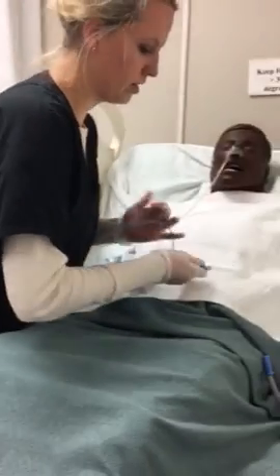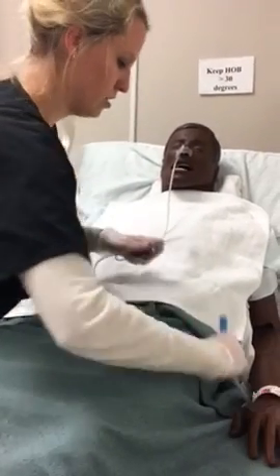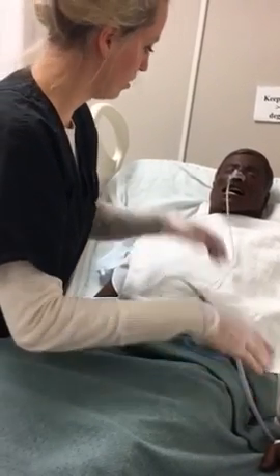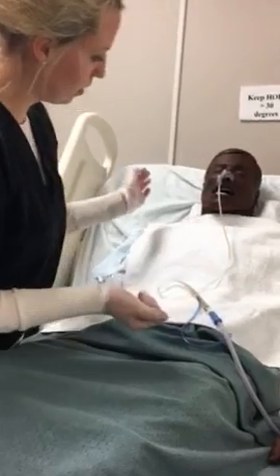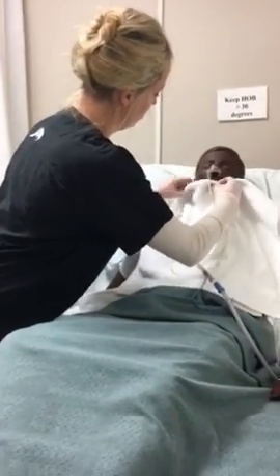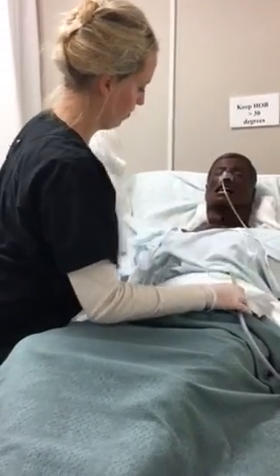Okay, and then I'm going to attach the tubing to some suction, and turn the suction on, make sure it's working properly. And then I'm going to perform some assessments on the patient. Mr. Templeton, are you experiencing any severe allergies currently? No? Okay.